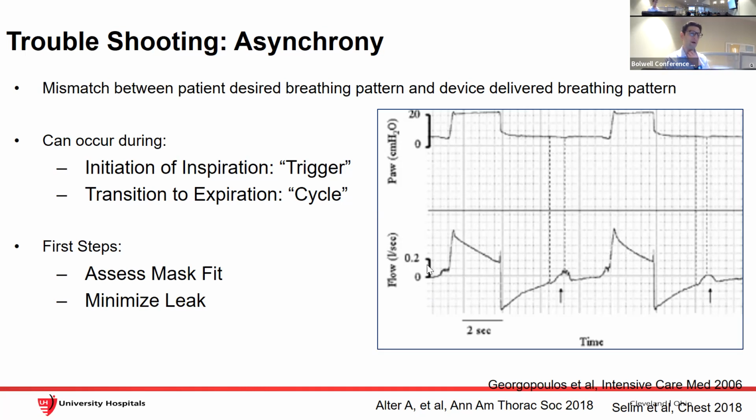Okay, so up is inspiratory flow, and down below the midline is expiratory flow. What I always tell the pulmonary fellows and the sleep fellows as well is that in addition to what Keenan teaches us, which you have to be able to label, start by labeling everything on the page, top to bottom, left to right, but also I will add, know what's up and what's down. Okay, and it's actually not simple.